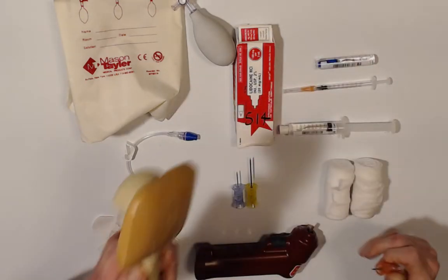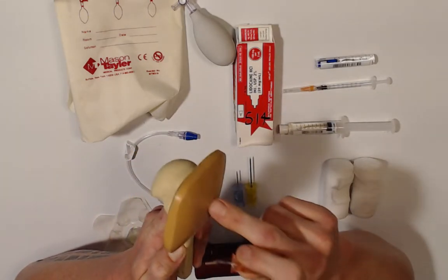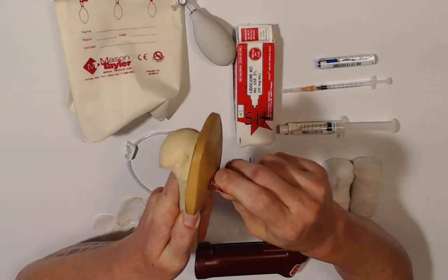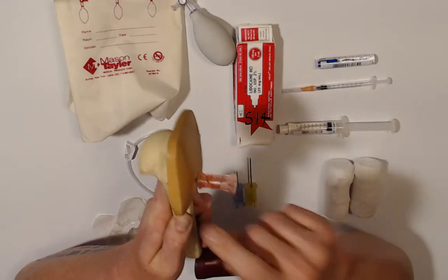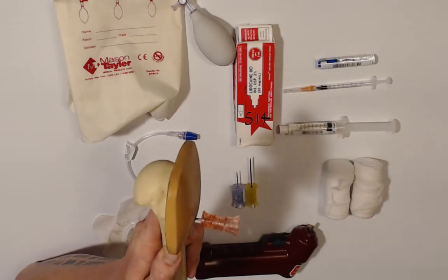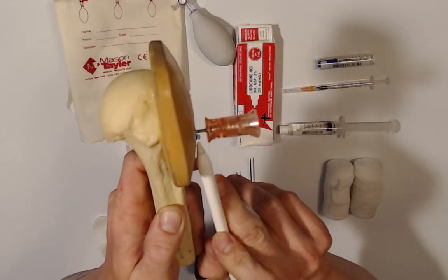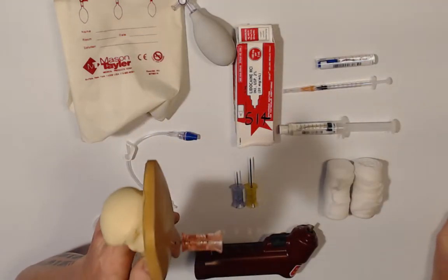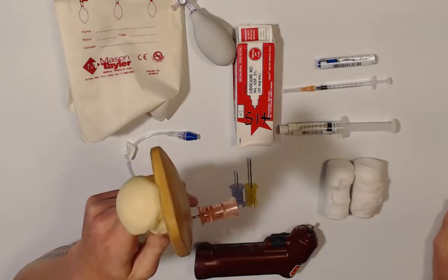Okay. So let's say that the first technique when we do an IO is we want to find our landmark, of course. We're going to push through the skin and we want to feel it hit up against the bone. Okay. Now, once you feel it hit the bone, what we're looking for is that 5mm mark to still be showing. Okay. If you can't see that 5mm mark because it's already in the tissue, then your IO needle is not long enough. Okay. We've selected the wrong one. You need to pull that out. Go get a bigger one.